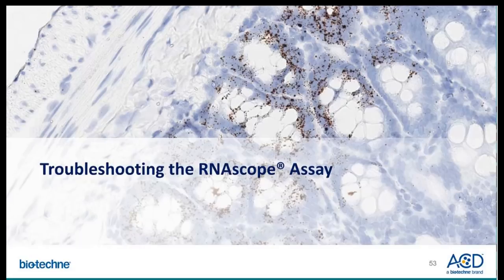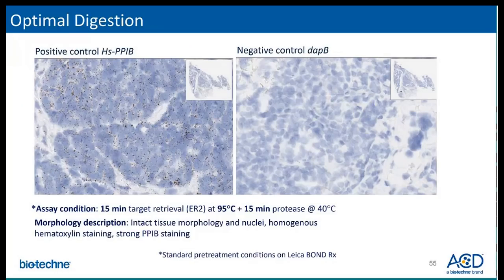Now let's review some troubleshooting examples. This shows optimal digestion with tissue fixed per our recommendations and treated with standard conditions. PPIB staining is strong, while the DapB negative control is clean. Tissue morphology is intact and the hematoxylin staining is homogenous. Note that this assay was run on the Leica Bond RX, so the pretreatment conditions shown are with regards to running on the automated platform.